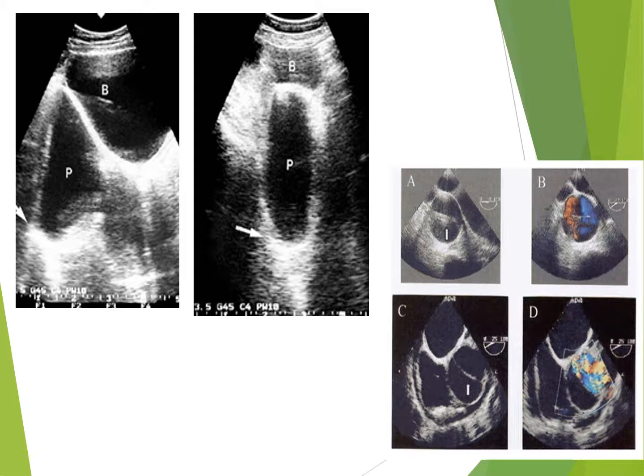Here we have an example. We have a bladder. And as the sound is coming in through this bladder, it's kind of bouncing around on a few things and then heading back to the transducer. Because of the multipath that it's taking, the machine thinks that it's running into real cystic structures, and it now has displaced kind of an odd cystic structure off to the side, because that's where the machine has figured out it belongs.